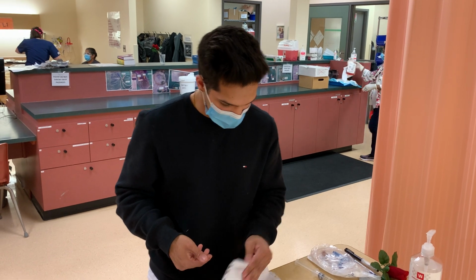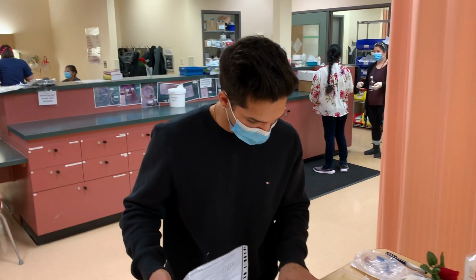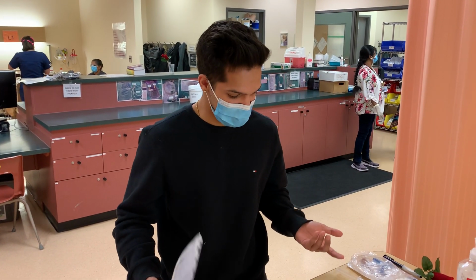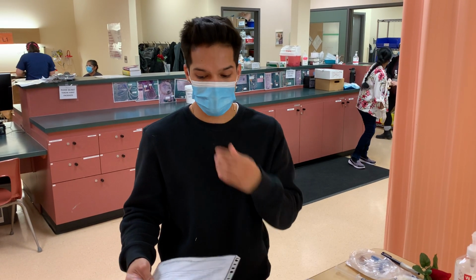Okay, and then once I've looked at that, I'm also going to be looking at compatibility. This is compatible with normal saline, which is good, which is what I'm going to be mixing it in. And then some potential hazards, hypoglycemia, such as blurred vision, sweating, tremors, palpitations. So I'll be taking those into account when I do my patient education.